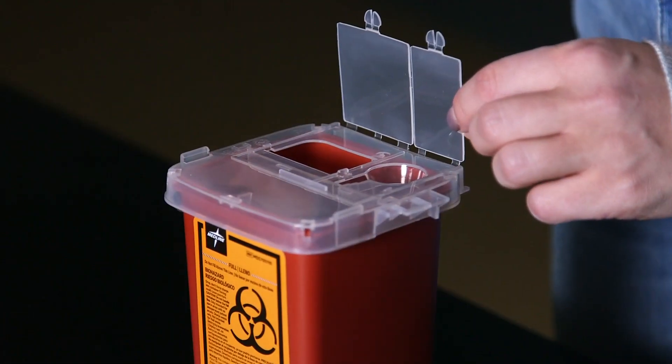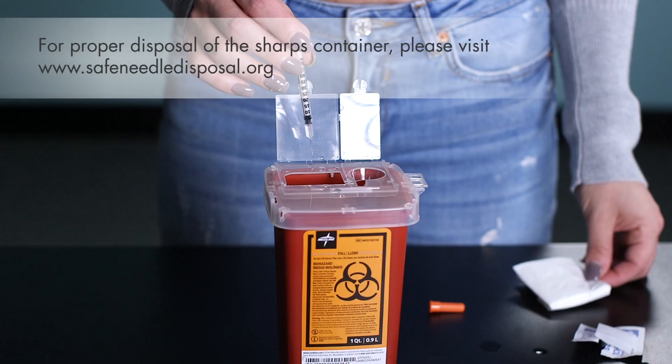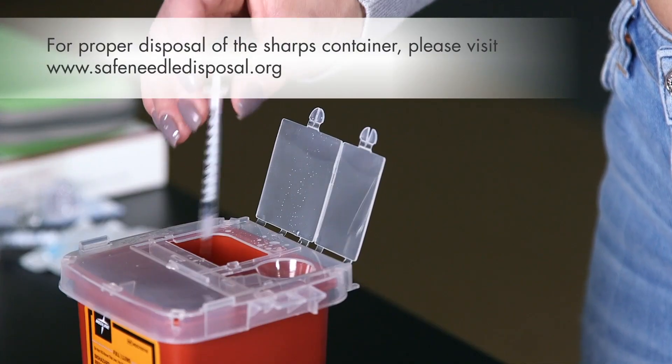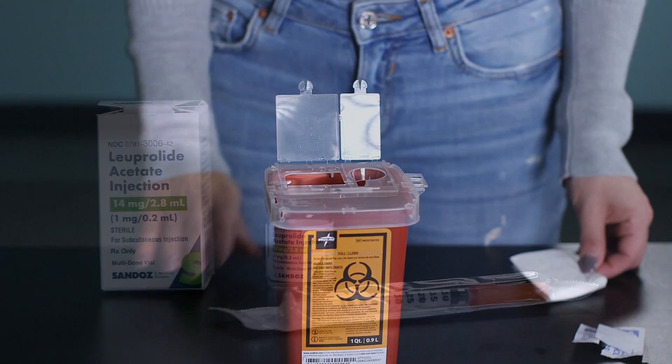The sharps container comes with a permanently sealable top. Open the lid. Do not recap the needle. Just drop the syringe into the sharps container. You can close the lid, but do not seal it until it's full.